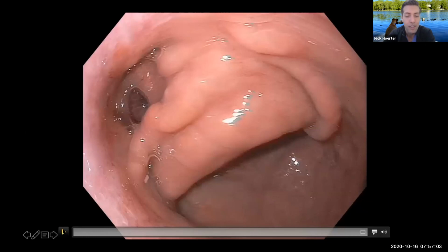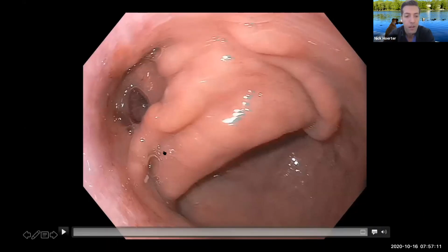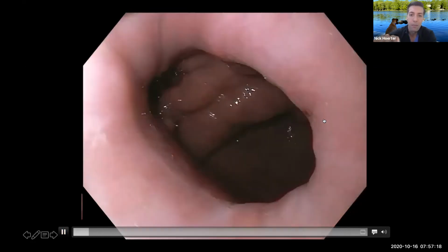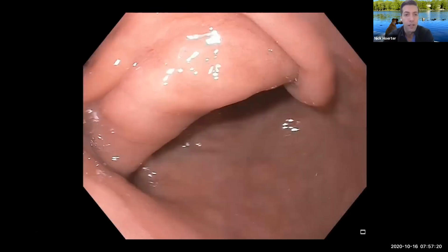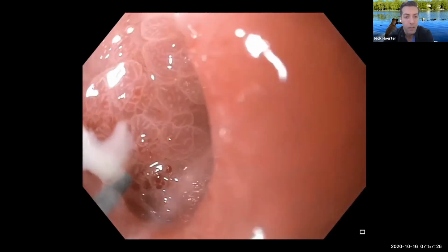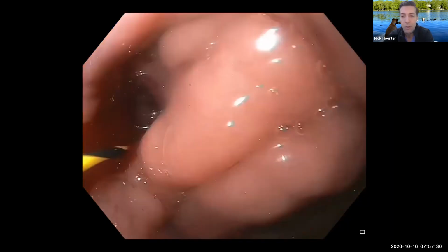And at this one, instead of attempting another fistula closure, because we had tried multimodal therapy at this point, which was unsuccessful, we attempted a different mechanism called endoscopic internal drainage, and I'll explain that. Again, she has this abnormal sleeve, the opening on the right, and then the little outpouching on the left. There are 2 visible fistulous tracts. One has pus coming out of it, and a wire, again, shows a complex fistula communicating with the sleeve here.